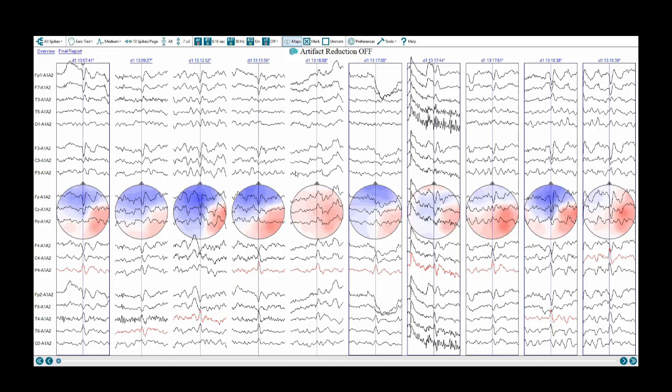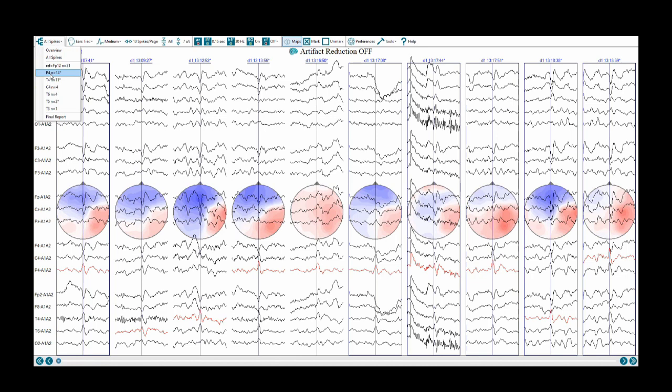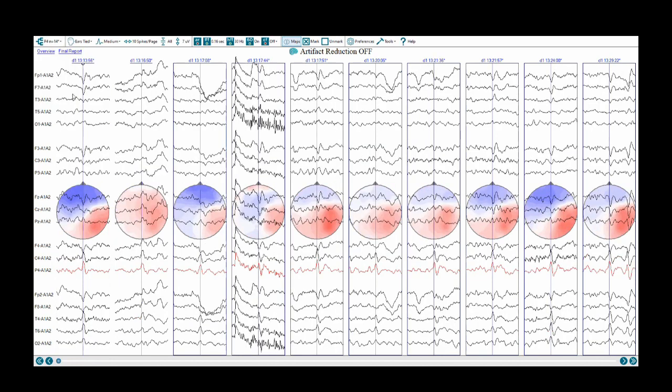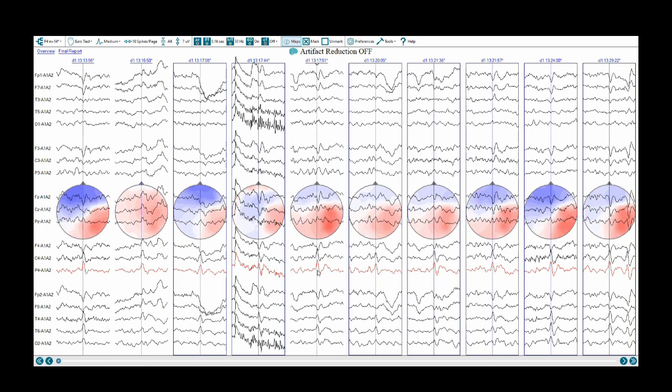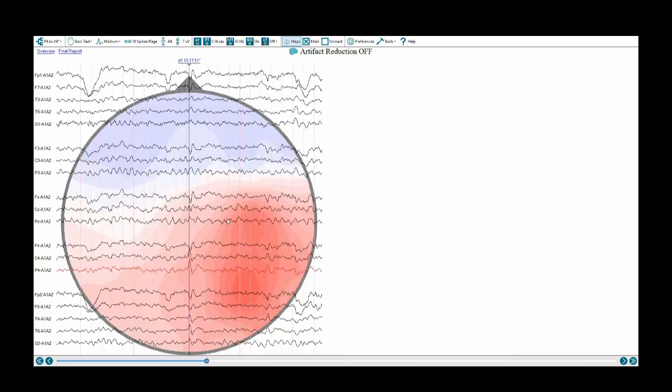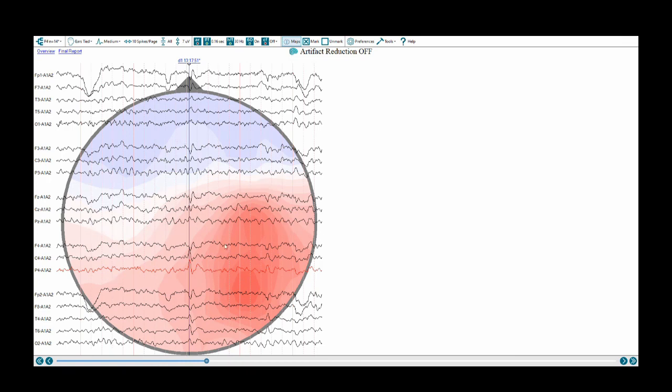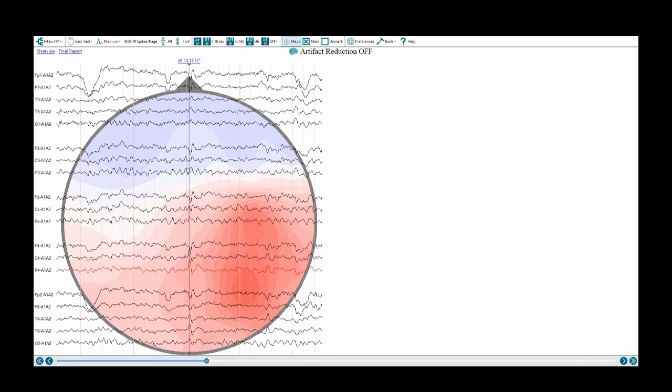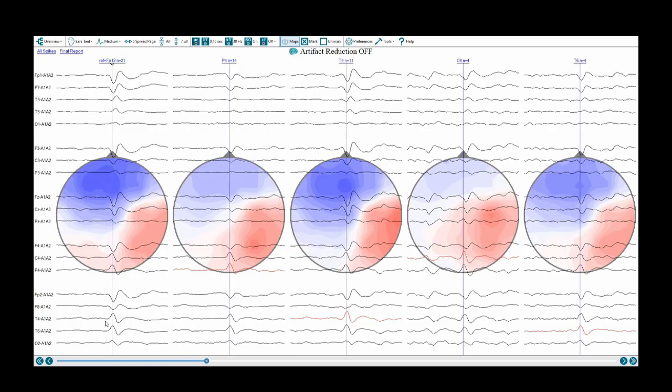Now we are going to look at Persist and its spike review. The algorithm at times will separate discharges that are apparently arising from the same focus. For this particular discharge, we can see maximal at P4. The red with Persist, the way the default settings are, represents negativity. The blue represents positivity. In a lot of programs this is flipped, but in this case, red is negative. We can see that in that right posterior region, maximally where the red is heaviest shaded, we can see that chief negative discharge. Then we can see over the frontal region a positive component. It's partitioned very cleanly.